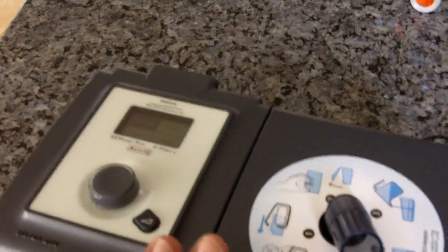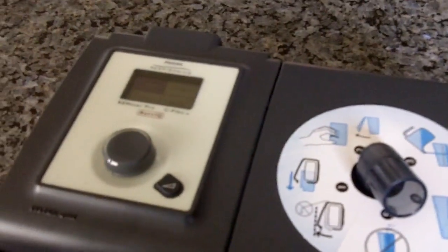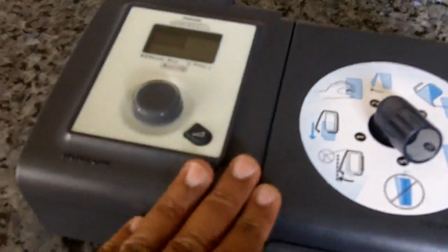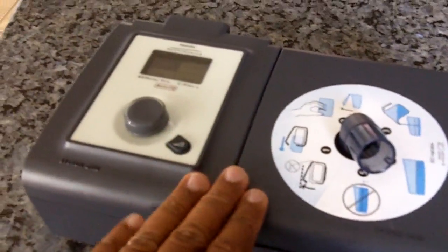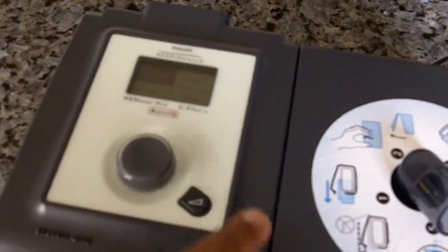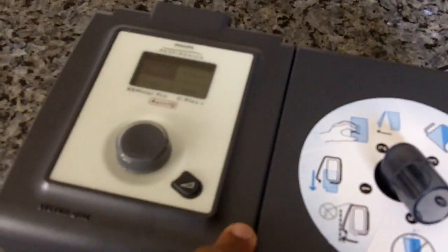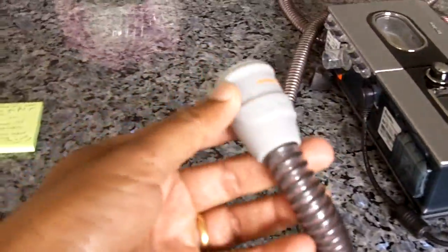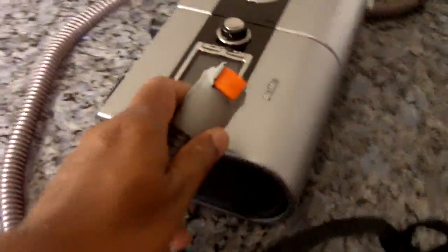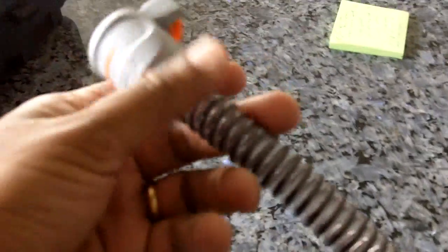Now, if you are somebody who needs a lot of moisture, it depends on the individual. All right. I'm going to suggest 2 things. If you just recently got this machine, I would urge you to see if they can get it exchanged. Get your doctor to have this exchanged out for a machine that has heated tubing. Now this belongs to ResMed. ResMed has always had this heated tubing that you can use with their CPAP machine.